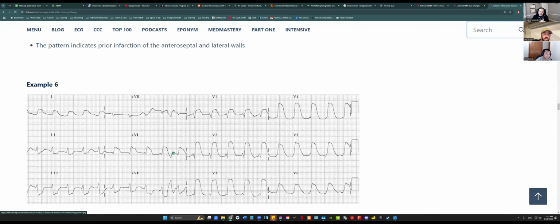Artifact. Okay. You see how it's weird up here too, and weird up here too? Right. So if something looks weird or if you're not sure, look vertically. Gotcha. Okay. Yeah, good question. I hope I gave you a good answer.